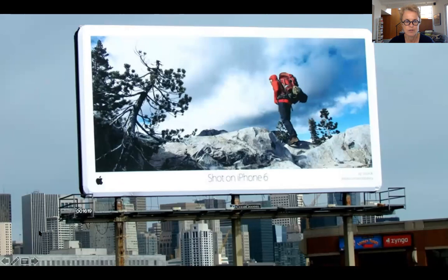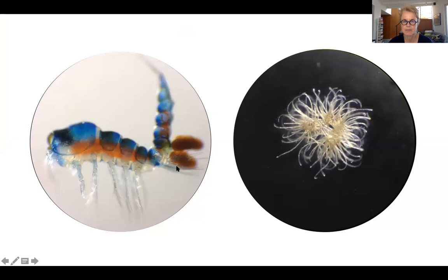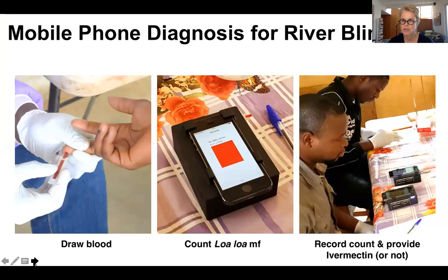And so with a CellScope, you can take pretty pictures of little aquatic animals in the Hawaiian ocean, or you can use it as a medical device in Cameroon to detect Loa loa microfilaria in the blood of people directly in the field, where the blood sample is inserted into this CellScope instrument, and within minutes the camera can decide whether there is a presence of the worm based on its movement or not, and that initiates then immediate therapy and the savior of many eyesights in these regions. And that's ongoing currently in Africa.